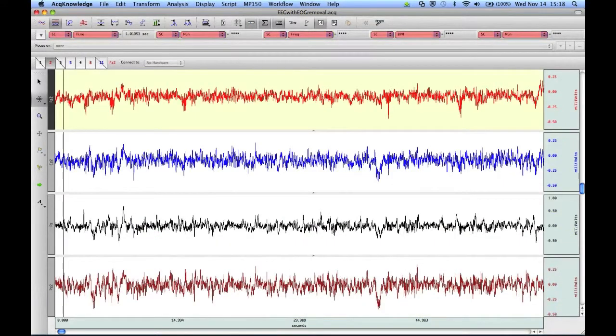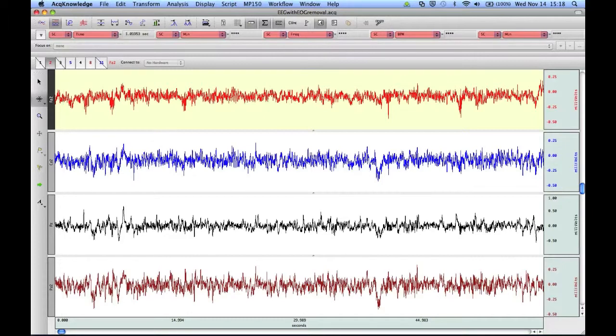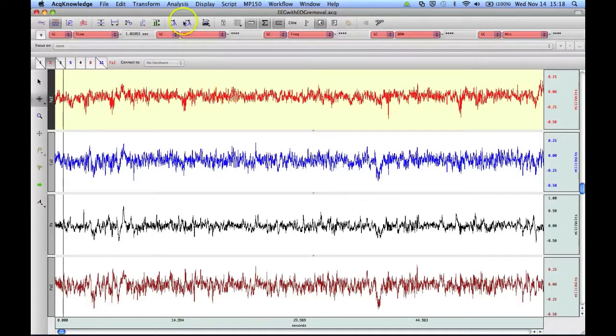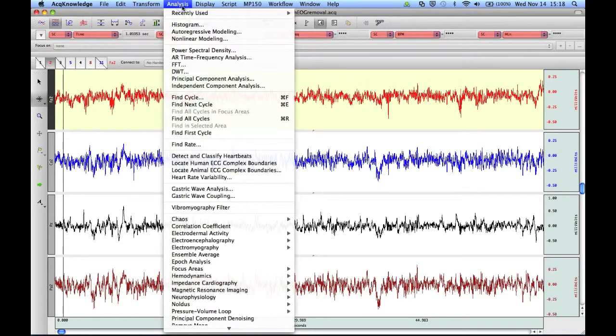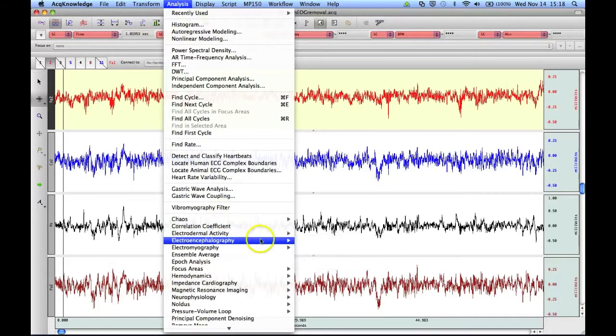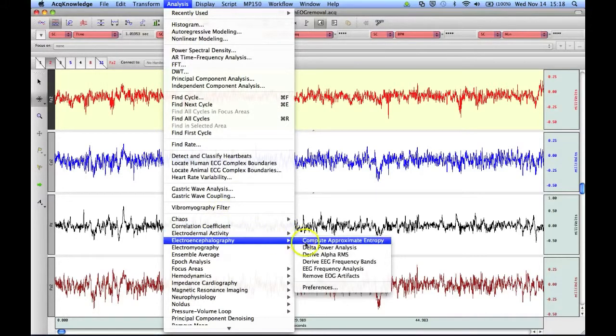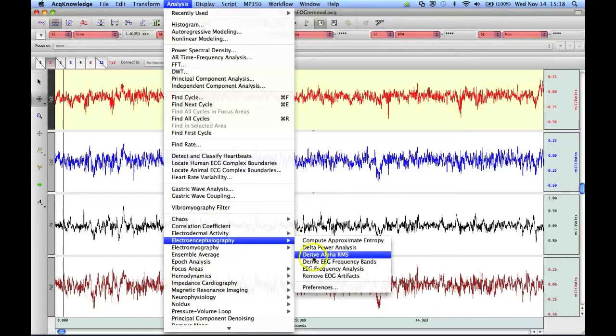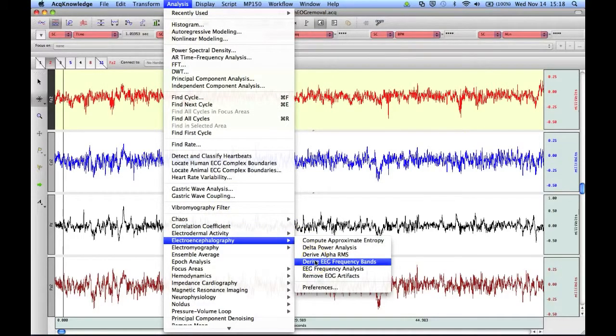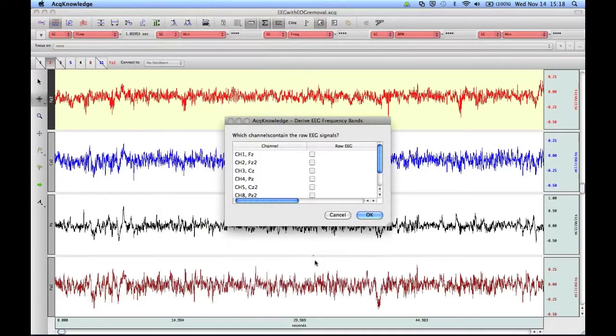Now let's take a look at the new Multi-channel Select feature for the Derive EEG Frequency Bands analysis. Again, we'll go to the Analysis menu and select Derive EEG Frequency Bands from the option list.